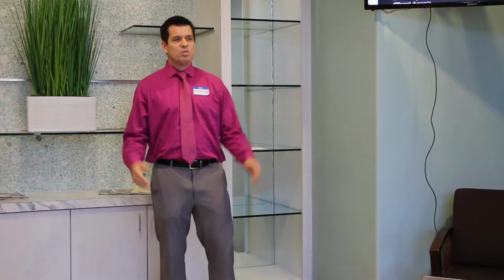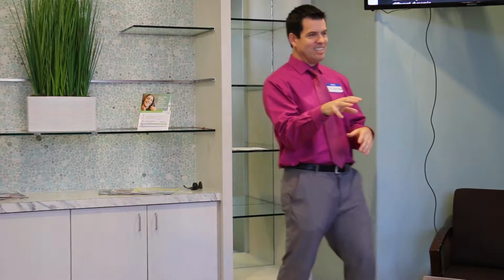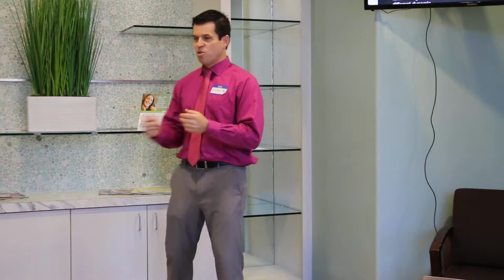Happens in my offices still. I wish it didn't. I'm trying to do better, okay? But we try and take a full arch set of photos so we can educate on all the teeth. When they're in for a limited exam, we want to show them what's going on and other teeth that may be of concern and how we prevent this from happening again. We want to drive them into our hygiene program. We want them to come back for a comp exam, right? We don't want to take that opportunity to only focus on single teeth. So intraoral cameras foster single tooth care. I think they're a crutch for a lot of dentists. They're not good. Does that make sense?